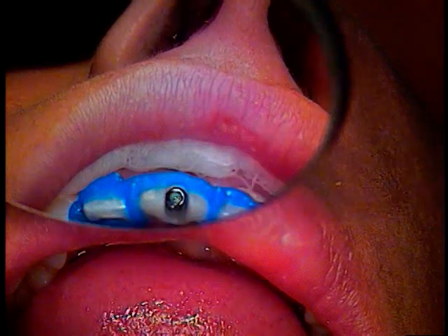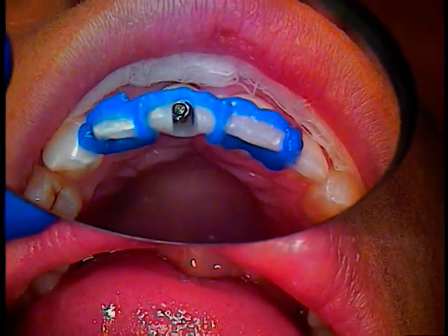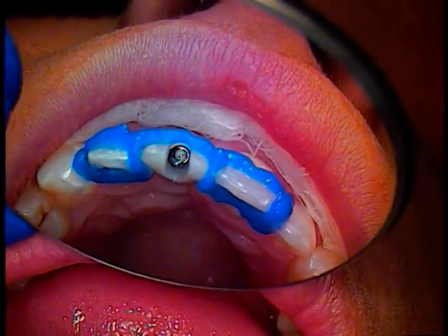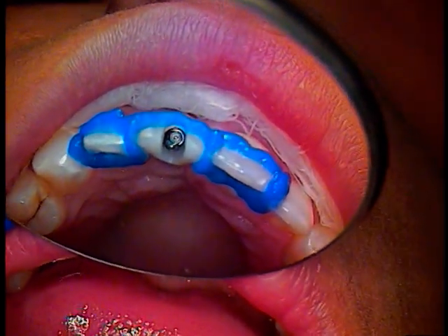Hello and welcome. This is Dr. Jerry Cuomo. I'm here with another rescue case in my private office. This one has been referred to me by a restorative dentist. Let's go through what we have. It's tooth number 9, which was restored years ago as a cementable implant-supported crown. It's been previously attempted by two clinicians without success.